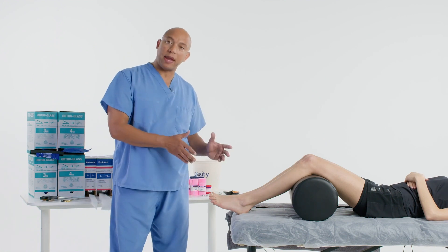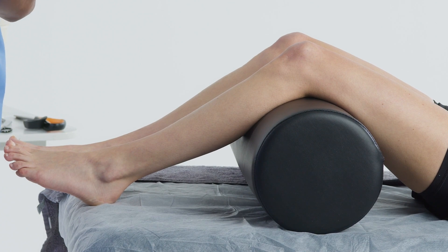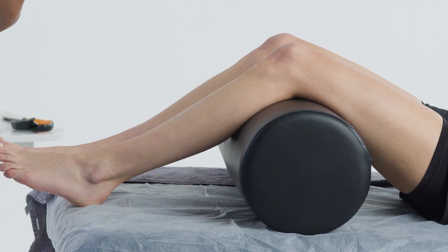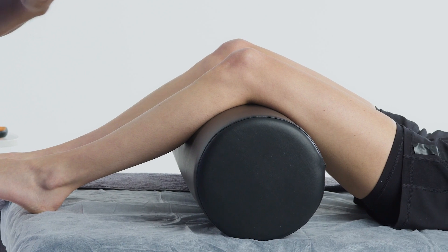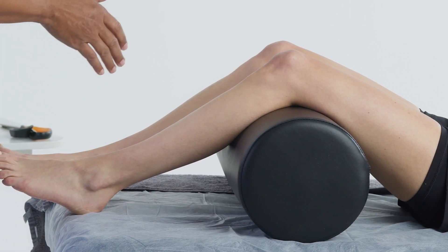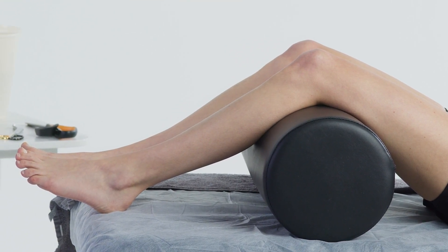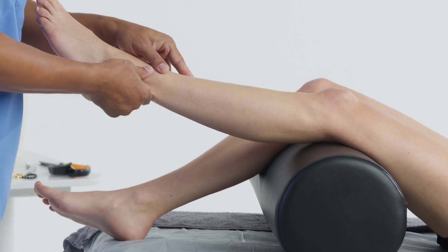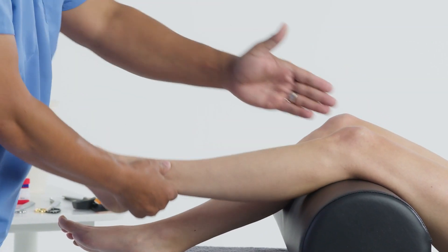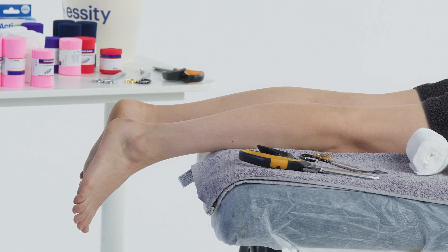The next position is the patient laying on their back. Sometimes this can be very comfortable for the patient, or sometimes it's not because maybe the patient has problems breathing, or maybe the patient is with child. We have the leg elevated above the chest so we don't have to worry about a whole bunch of pooling of fluid going distally, so we can take care of the patient's extremity without a lot of effort.